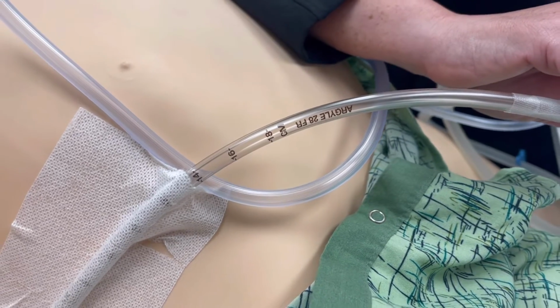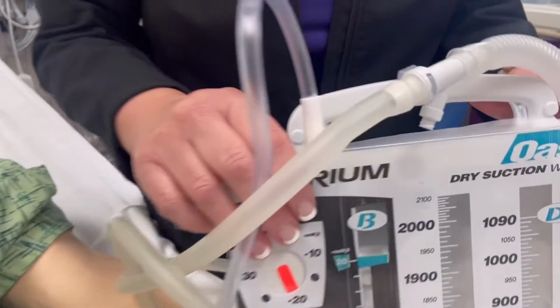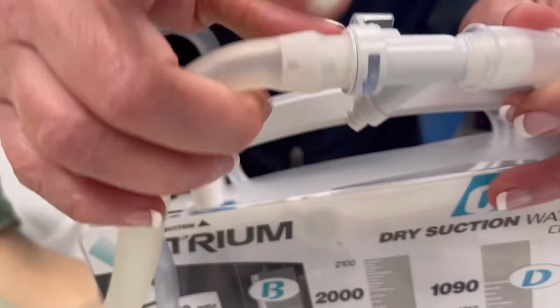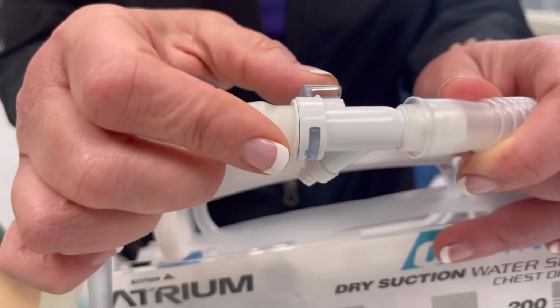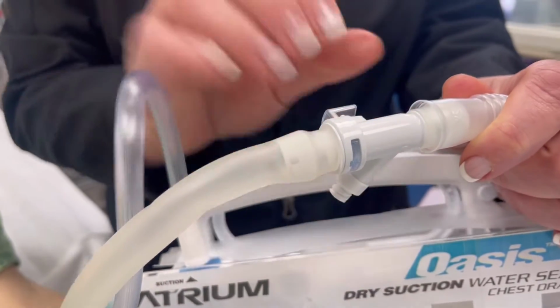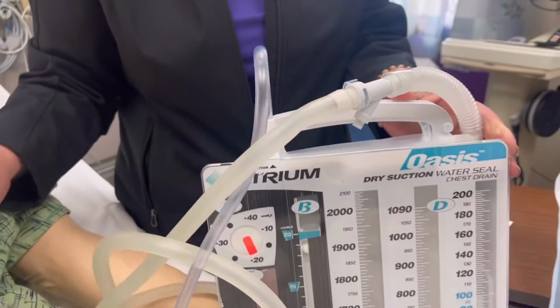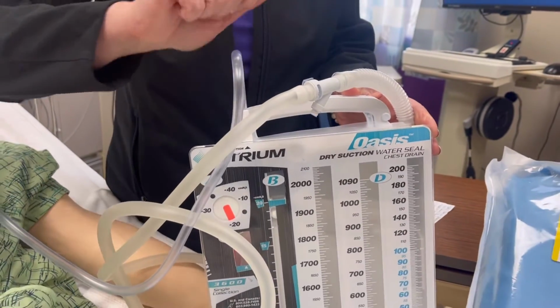If none of these measures will resolve it, the next step would be to call the provider, but there's one last place to check, and that's where the atrium tubing actually connects to the atrium device. So this is one last place where you want to check and make sure that you don't have a loose connection.